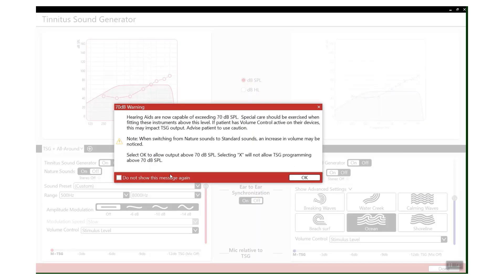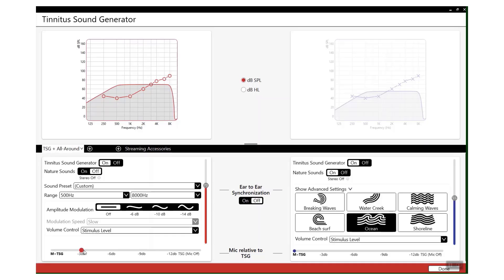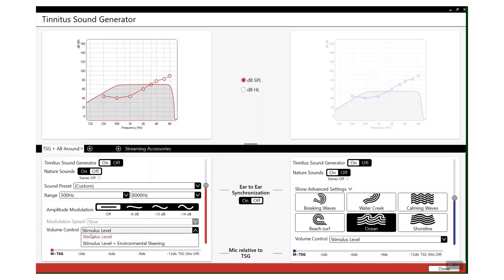That enable you to hopefully help that patient manage their tinnitus. You can increase the intensity. You will get a warning when you go above 70 - which you can click OK if you do need to prescribe above, just do so with caution. You can increase the mic relative to the tinnitus sound generator, so you can reduce the amount of input coming from the mics and increase the amount of input coming from the tinnitus sound generator. And you can also manipulate the volume control, so you can have stimulus level or stimulus level plus environmental steering.